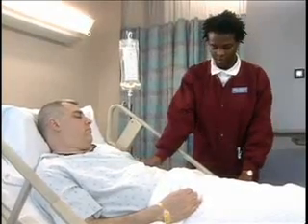And what was the problem we found? The IV had been placed in the antecubital fossa, and his arm had been bent at the elbow for a long period of time. This can also happen if the IV is in the wrist and the wrist is bent. Right. So we explained what was happening to the patient, then he understood that he needed to try to keep his arm straight most of the time.